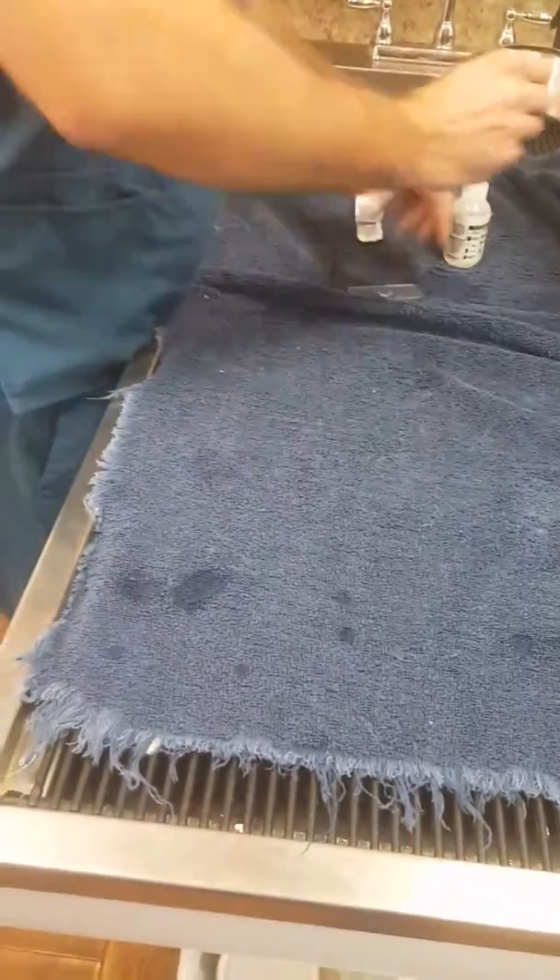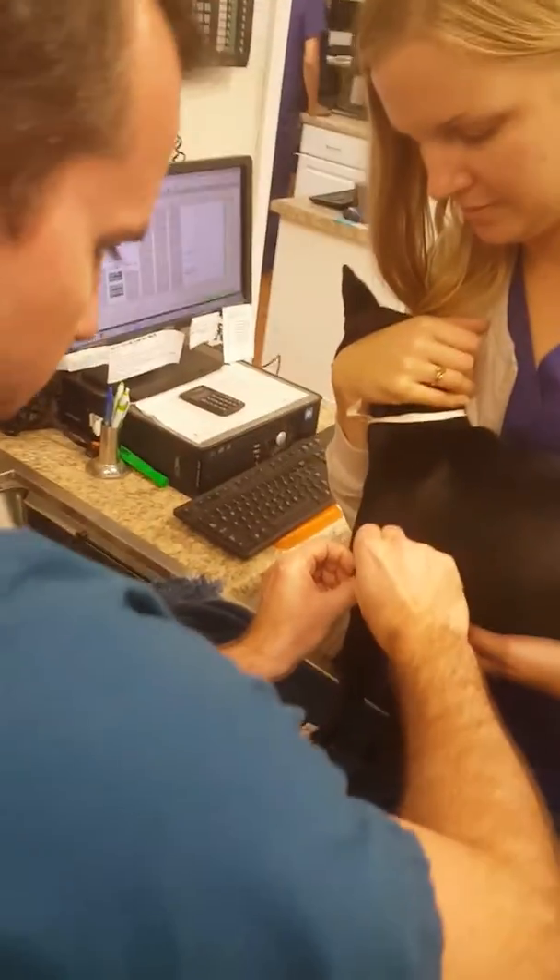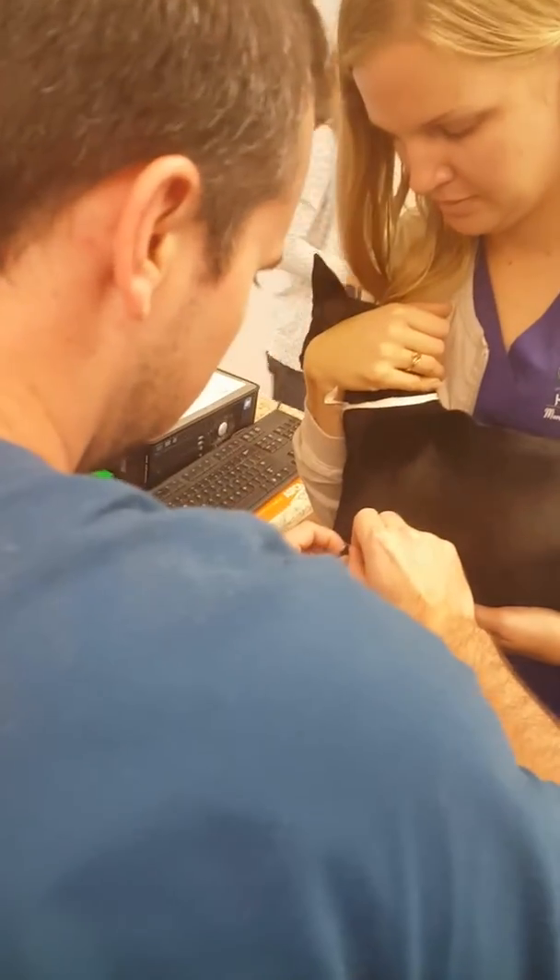We're going to scrape three different areas. So I'm going to pinch the skin up and I'm just going to scrape until we get a little bit of blood. And then I'm going to put that onto the slide.